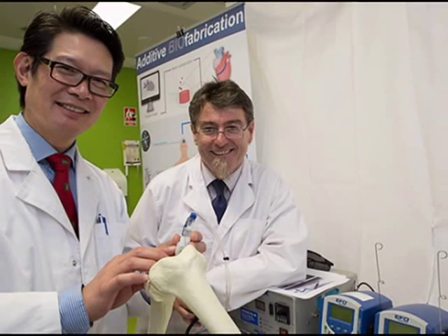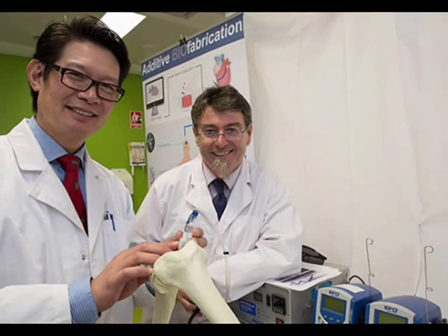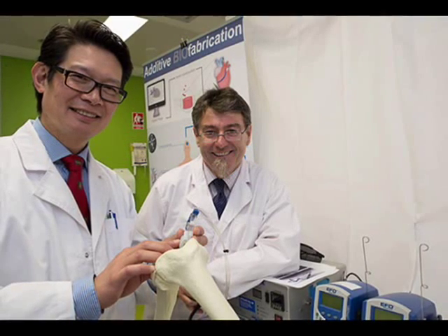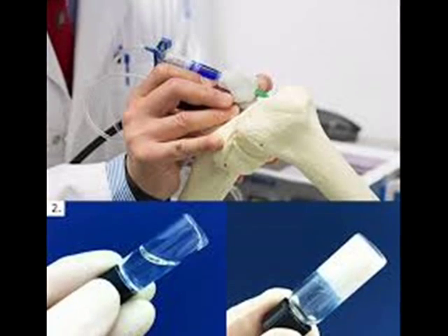The device can also be seeded with growth factors or other drugs to assist regrowth and recovery, while the handheld design allows for precision in the operating theater and ease of transportation.